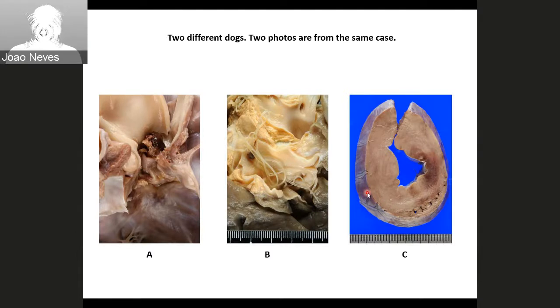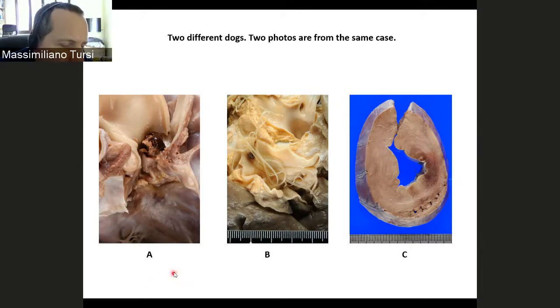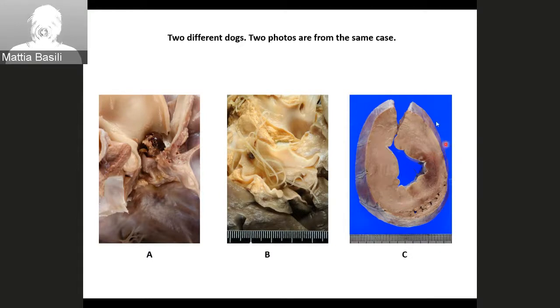It's a pulmonary artery, but I've also got two questions that I forgot to ask, very quickly. The first one is, do you think that this C section, the C picture, is slightly hypertrophied on the opposite wall to the infarction? Okay, from picture A we cannot say there is hypertrophy, but we may say so in C, yes.